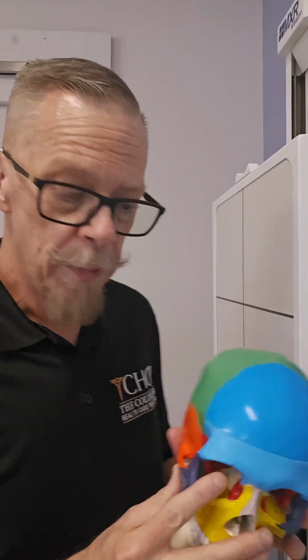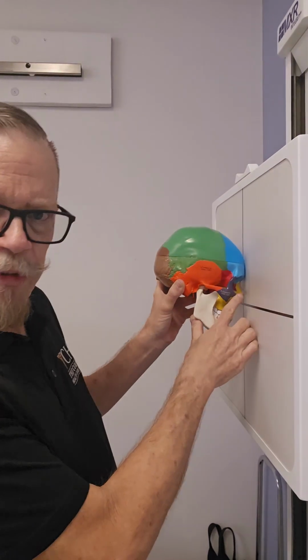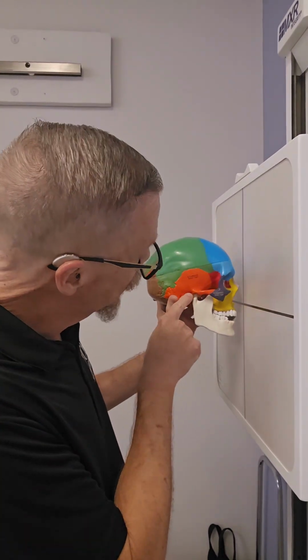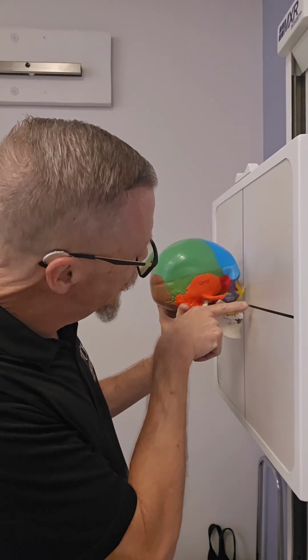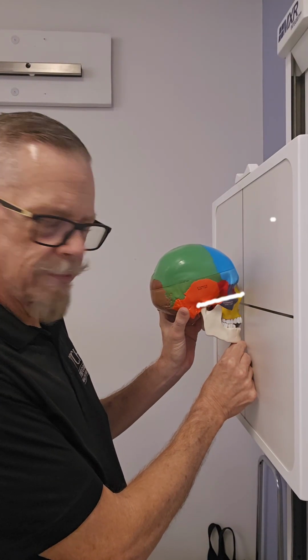The IOML is the infraorbital meatal line, which is the inferior part of the orbit. On a person, it's going to be right down here, the little bony structure. For that, we're not going to have as much flexion of the skull. We're going to have a little more extension. So we want from here to the inferior orbit. That one's going to look about like that.